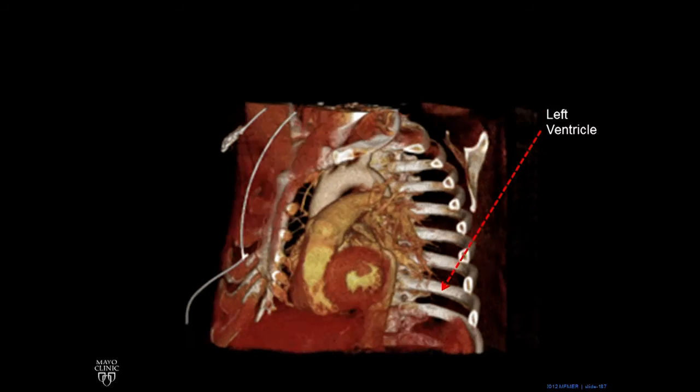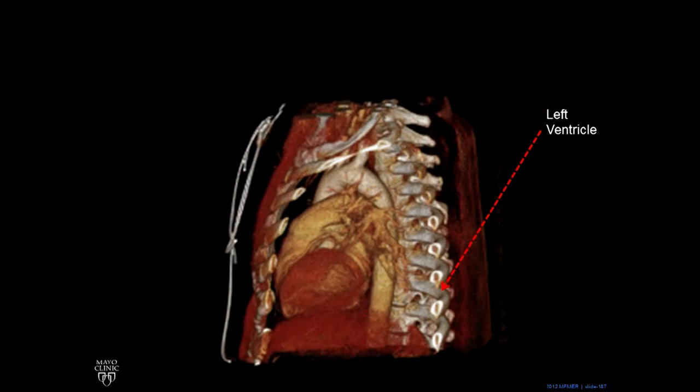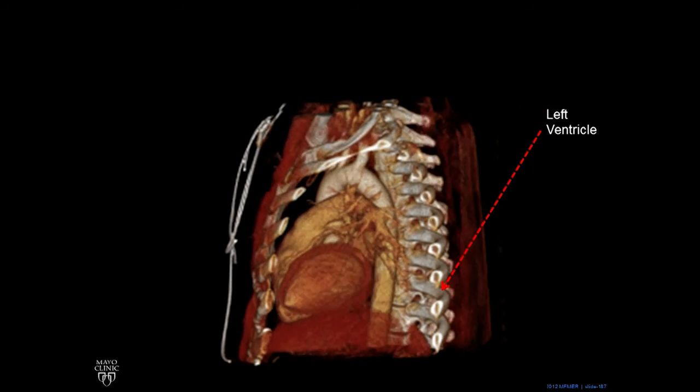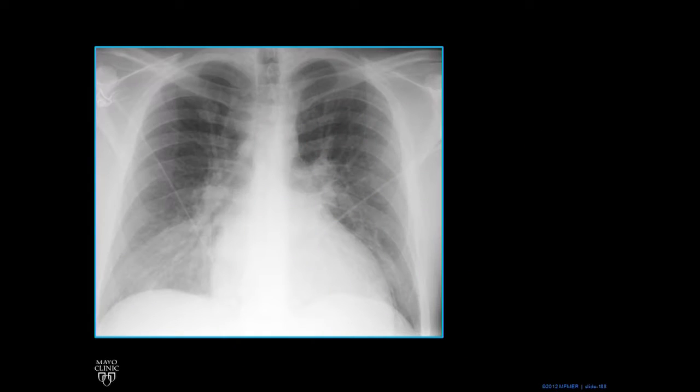We rotate it around, and now you can see the sort of football shape to it, and it points not straight to the left, but a little bit off axis.